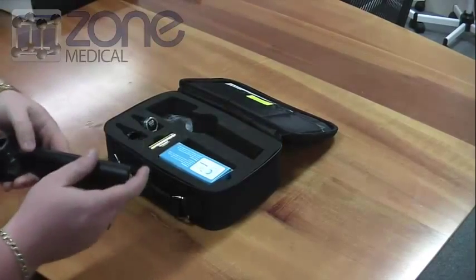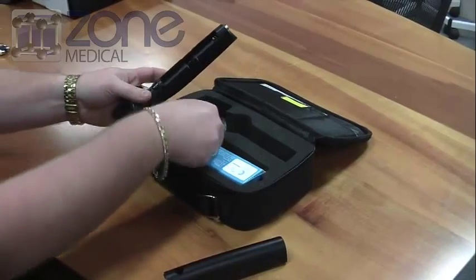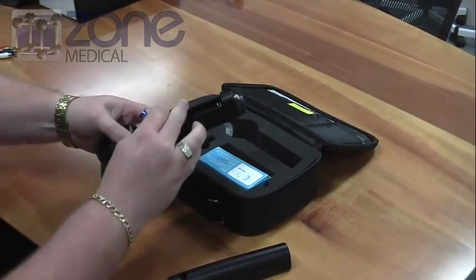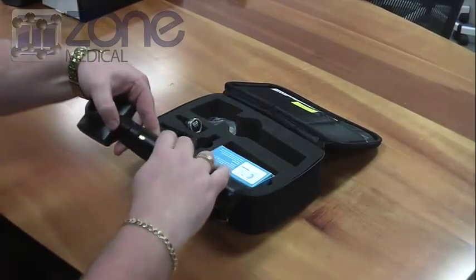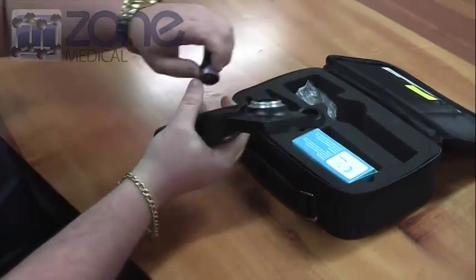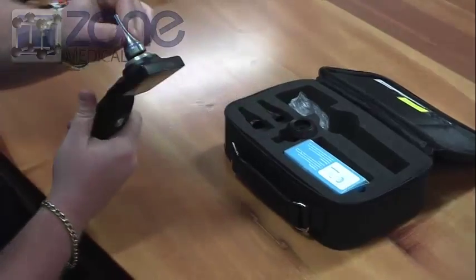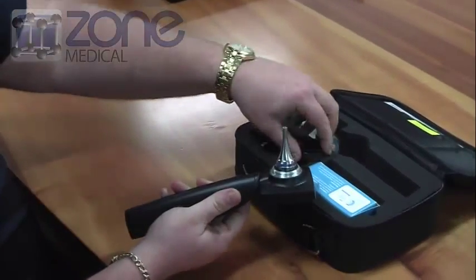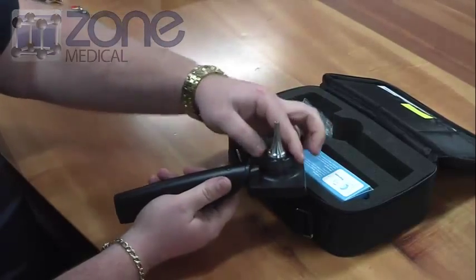To power up the device, simply remove the battery cover and insert the provided AA batteries. Then insert the camera tip supplied in the kit and tighten the locking ring.